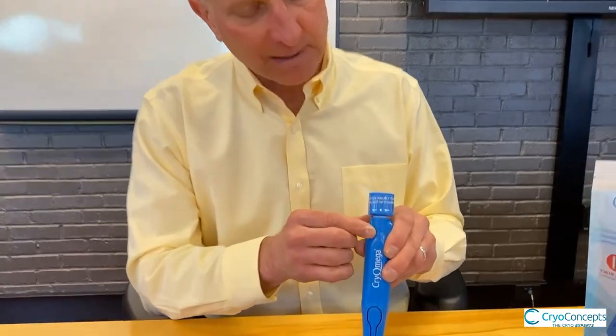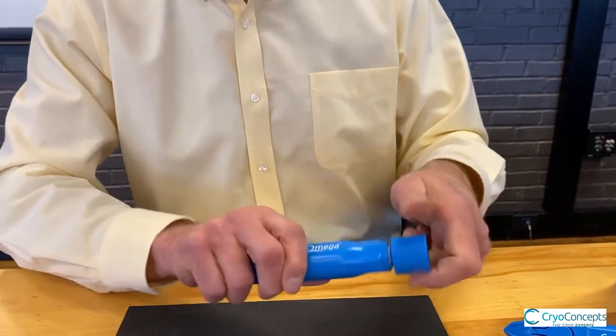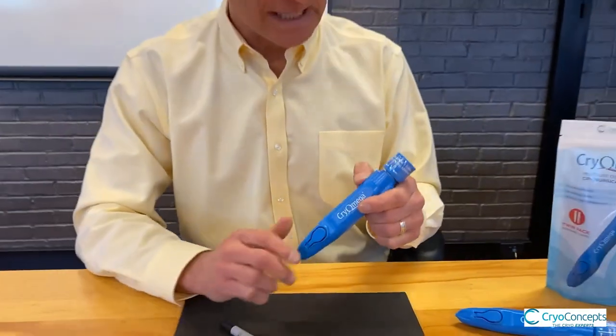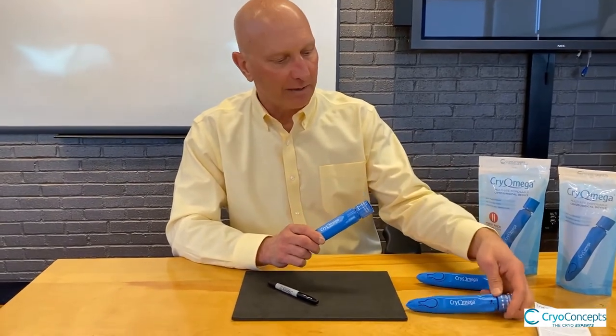To activate the device, you'll notice that there's a dot on the knob at the top and an arrow underneath. You simply grab the knob and rotate it 360 degrees to the same starting position. A helpful hint so you remember that you've done it is to take a Sharpie and mark it with an X, the date, or whatever you would like.